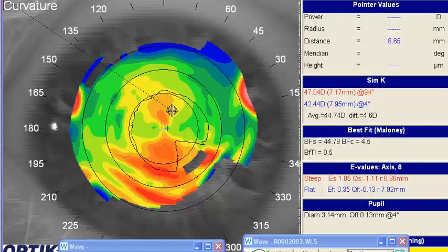As you know, your patient has quite a bit of corneal cylinder, about four plus diopters, and this lens most likely, when the patient's looking off to the right, with those tight lids, is causing that one edge of the lens to pop off, thus allowing it to pop off the eye. So the natural fix for that, generally, as you know, is just going to a larger design. If you go from a 13/8 maybe up another millimeter to 14/8, that may on its own solve the problem for you. However, there's another thought that may be helpful in this case.